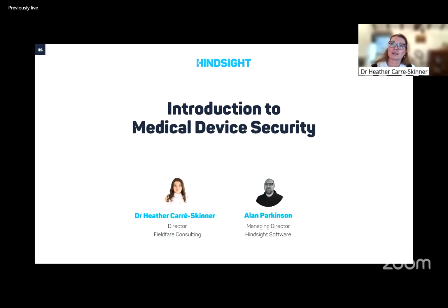what do you think in the future is going to be the biggest sort of cyber risk to devices? Is there something coming that we haven't thought about yet? So ransomware is quite a popular attack at the moment. Ransomware is disabling or stealing or locking away files and demanding a ransom for them to be unlocked. Having good encryption and things like that is a good way of stopping yourself becoming a victim of that. What's going to happen is, I think there's going to be some high-profile incidents.